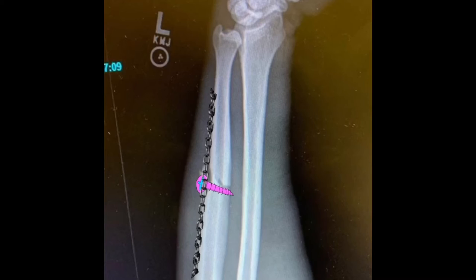After our lag screw is secured, we can now apply the plate onto the surface of the bone. We want the plate to be long enough where we can get at least three screws on either side of the fracture.